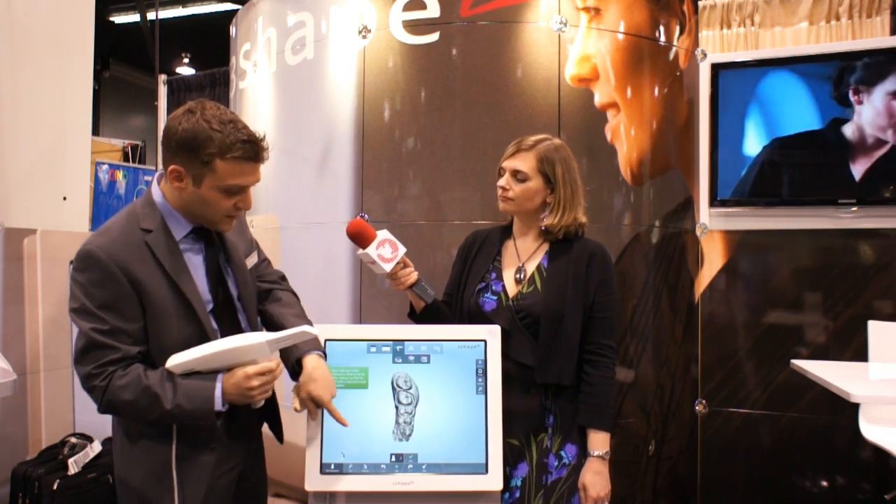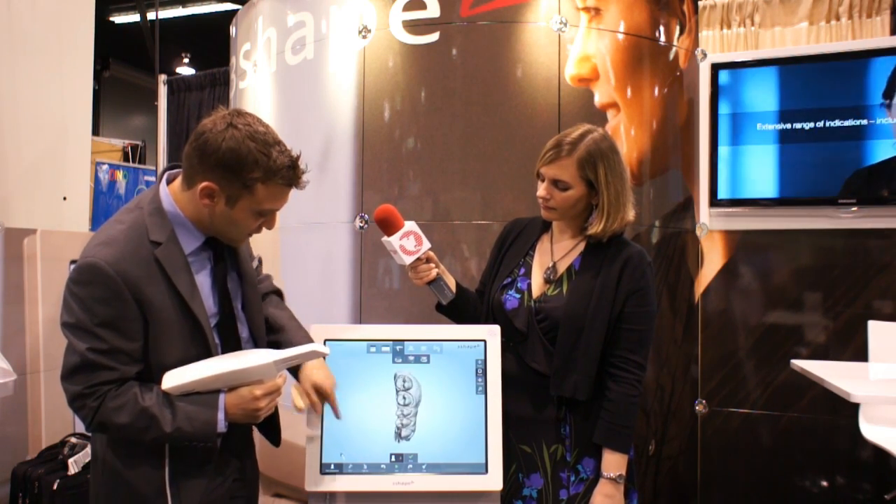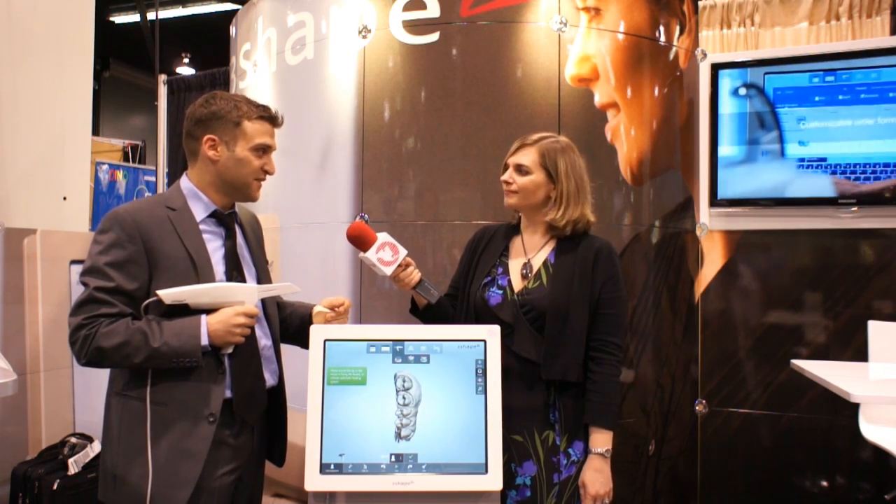So you can see now the scanner — we can rotate it. It took us a very short time to scan a small quadrant. Absolutely, that was very fast and the touch screen looks like it's very easy to use. Yes, it is very easy to use. It was designed to be made easy to use.